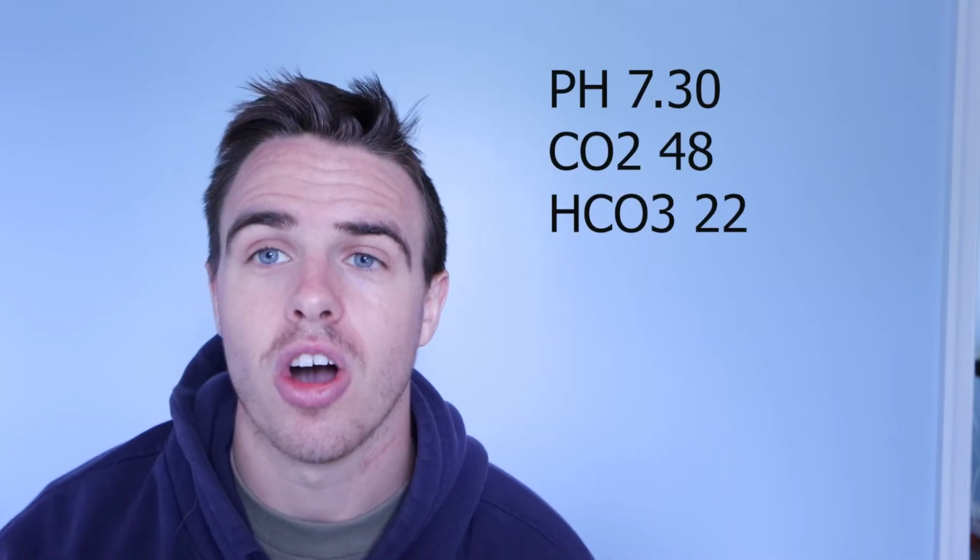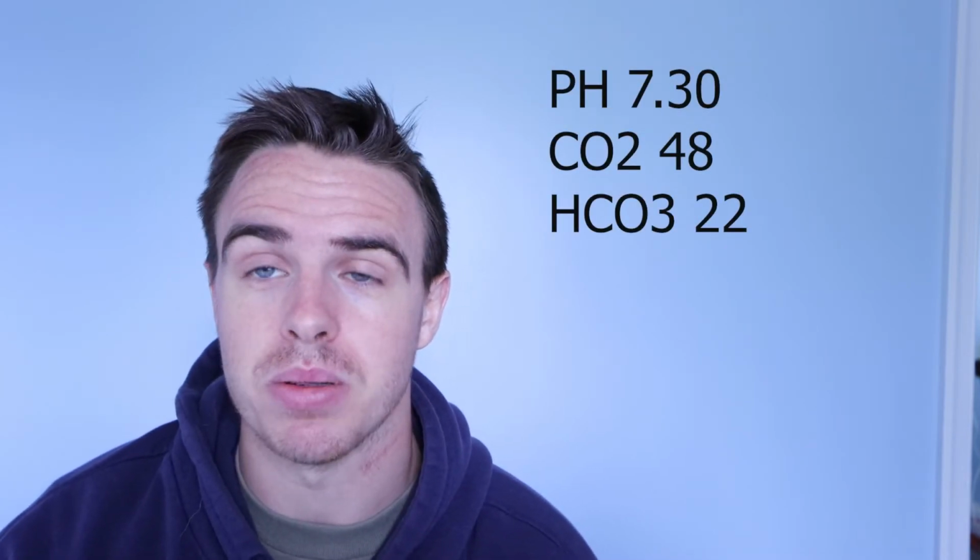Once you understand how to figure out the pH by just looking at the CO2 and bicarb individually, we want to go ahead and mix those two concepts together. And if you have mastered them individually, this should not be that difficult. So let's look at this one here. Our pH is 7.30, our CO2 is 48, and our bicarb is 22.